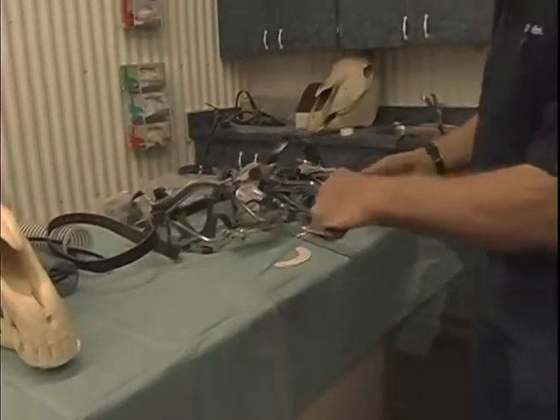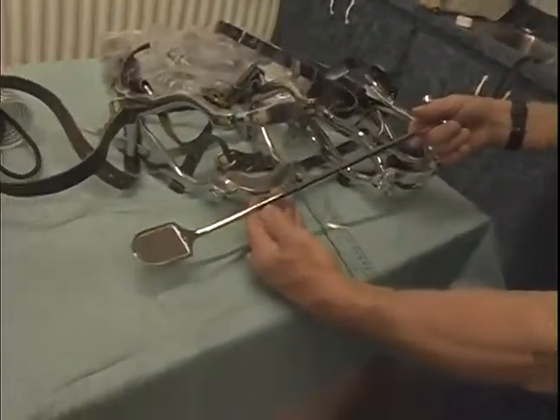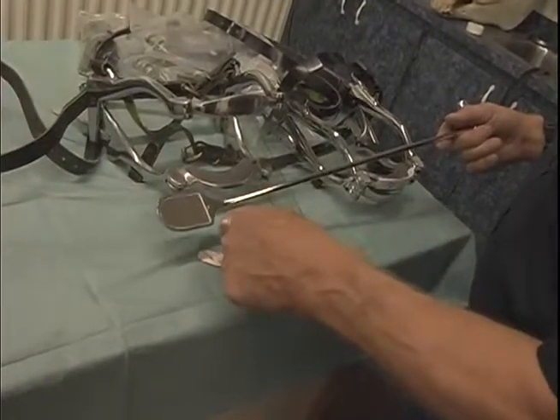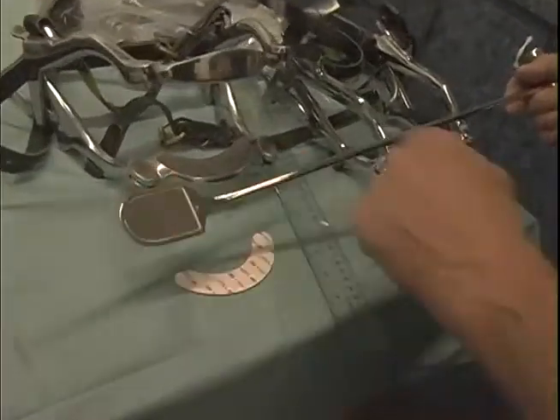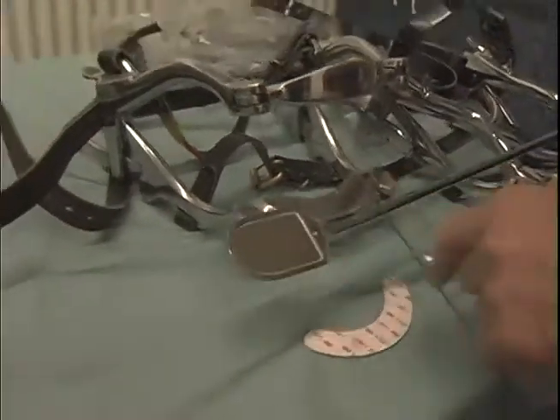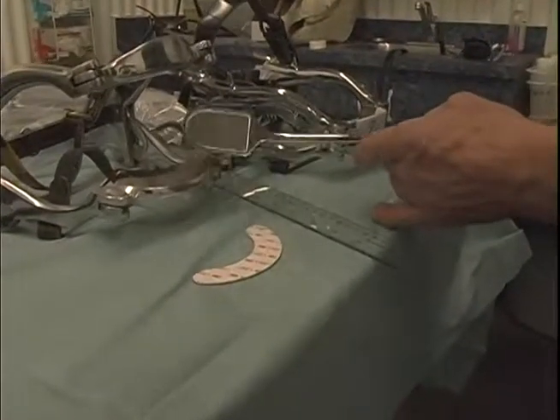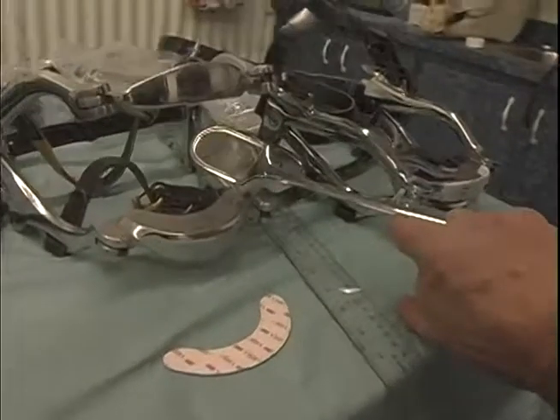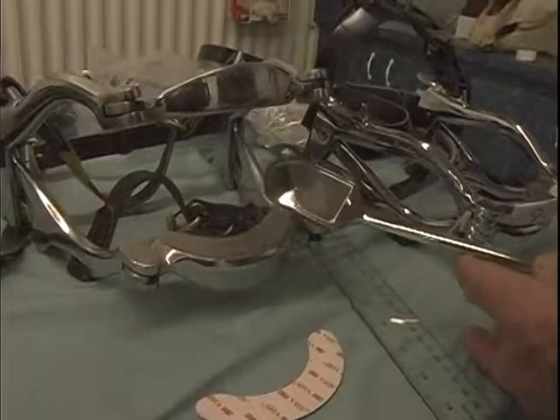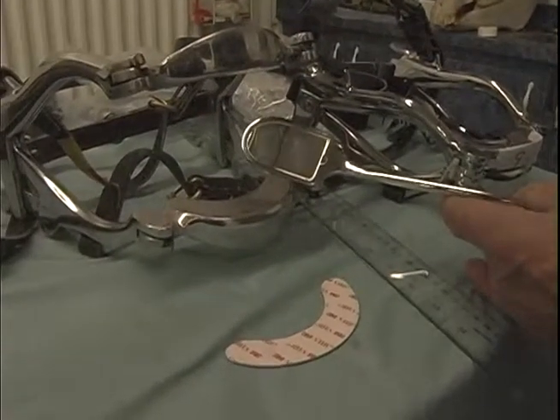This is an examination mirror made by PowerFloat. The features of this mirror are that it's not round. I've turned it into a round nose on a rectangle. And the reason for that is the round mirrors are so tight in the back of the mouth. When you get into the back of the mouth of the horse, it's so tight at the back you can't get the mirror pushed out against the cheek. This narrower, longer design makes it much easier to examine the horse with a mirror in the back of the mouth.